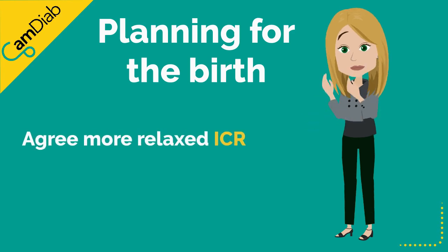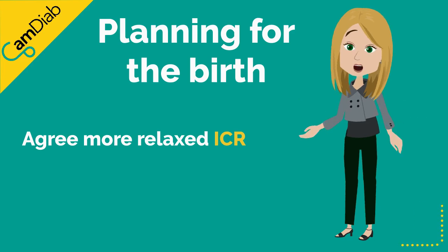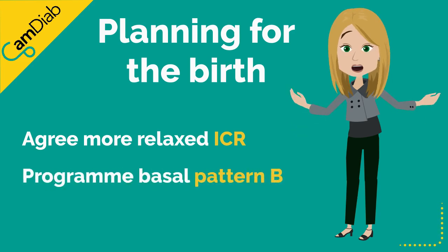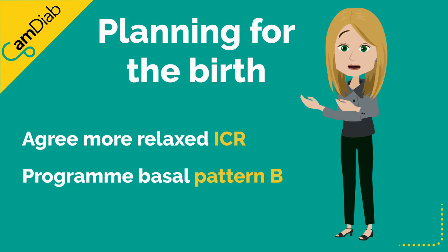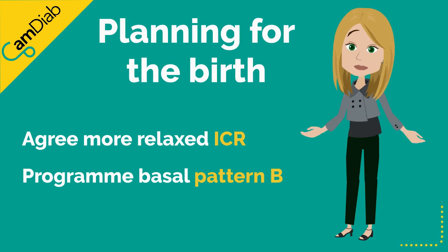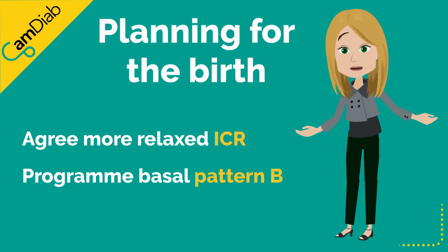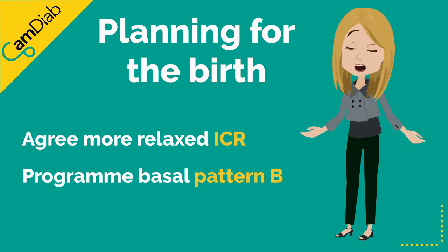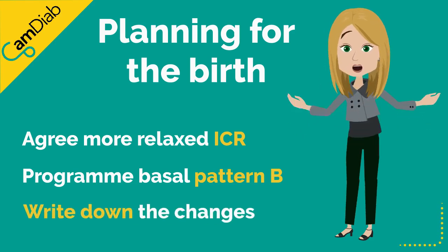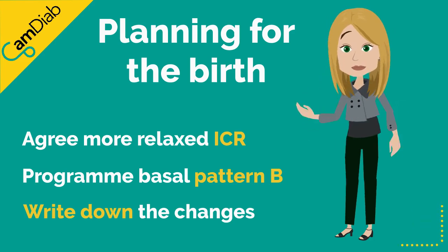Agree more relaxed insulin to carbohydrate ratios with your diabetes team, which can be programmed into the CamAPS bolus calculator settings after the birth. Program a reduced pump basal pattern B on the pump. Pattern A's basal rate would have been increased throughout the pregnancy as a safety net in case CamAPS FX couldn't work. Only swap to pattern B on the pump when the baby is born. All these changes should be written down in your medical notes, and you should also have a copy.